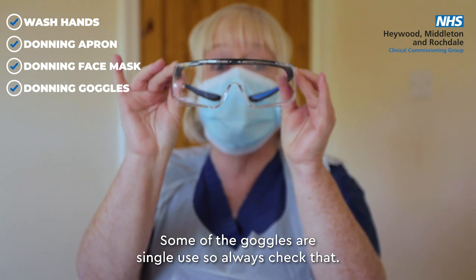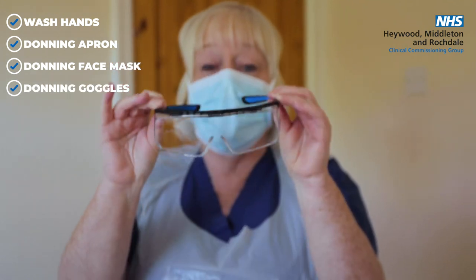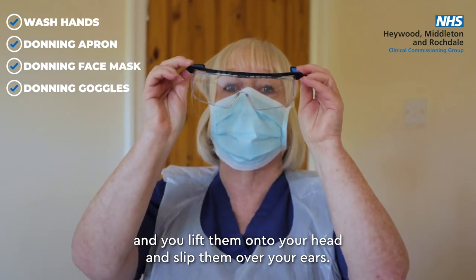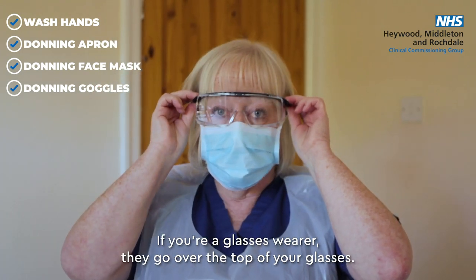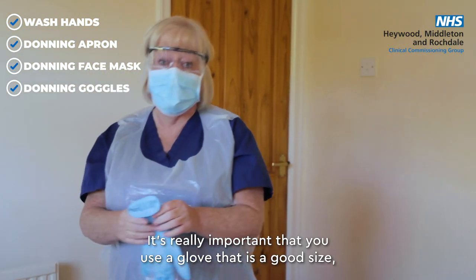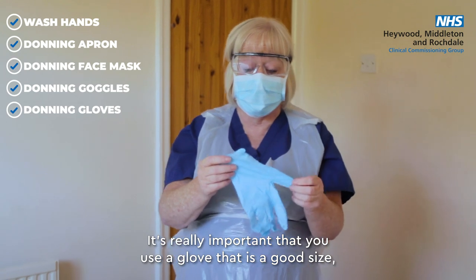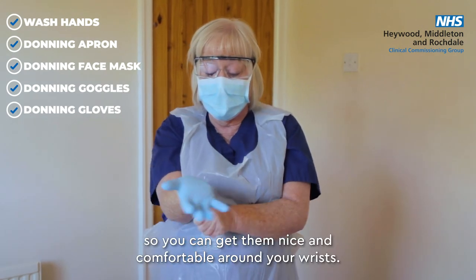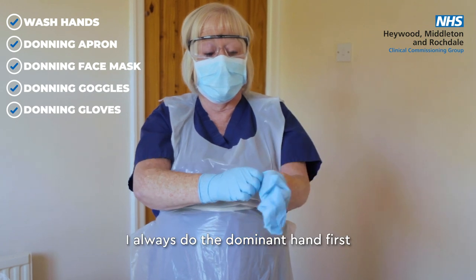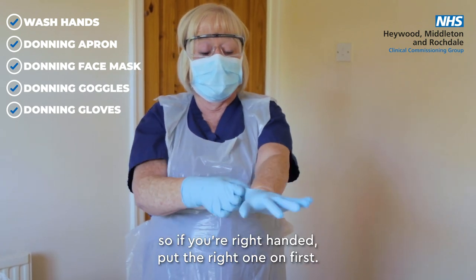Some goggles are single use, so always check that. Take the goggles by the arms, lift them onto your head and slip them over your ears. If you're a glasses wearer, they go over the top of the glasses. It's really important that you use a glove that is a good size so you can get them comfortable around your wrists. Always put the dominant hand on first.